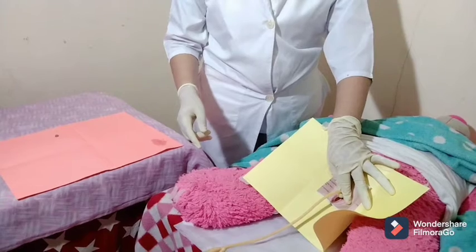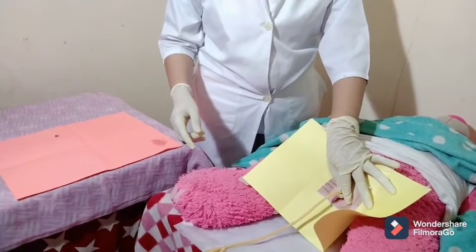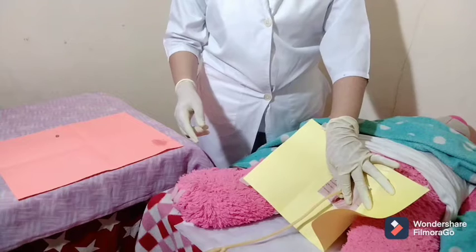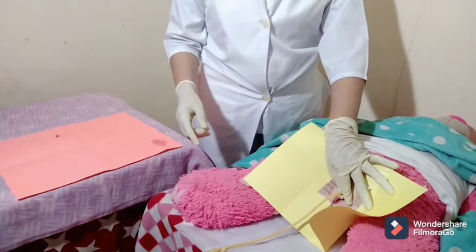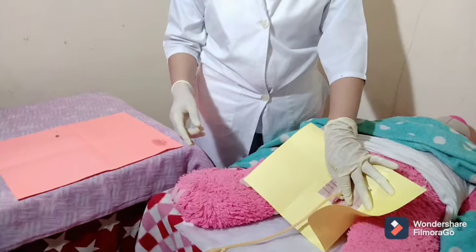If a Foley catheter is used, introduce 5 cc, or follow the manufacturer's instruction, of distilled water to secure the catheter. Gently pull the catheter until the retention balloon is snug against the bladder neck. Resistance will be met. Remove the fenestrated drape. This creates a balloon to ensure catheter retention and maximizes continuous bladder drainage. Proper attachment prevents trauma to the urethra and meatus from tension on the tubing.